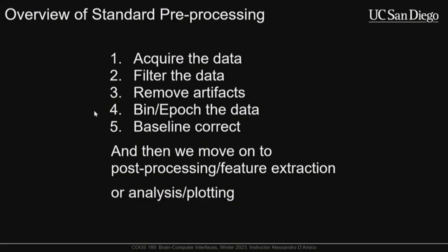This is a general set of tips. This is a very common set of things you would do to pre-process any EEG data or neural time series data. But again, it's not exhaustive, and today we're mostly going to be focusing on filtering the data.